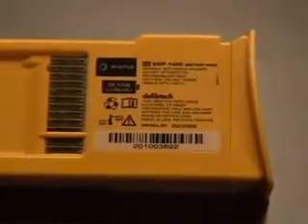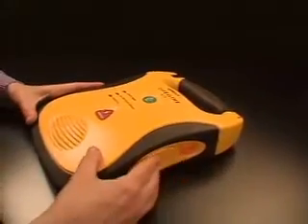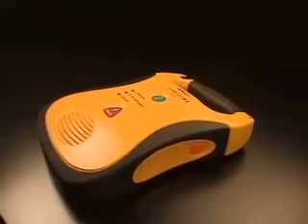If you have a spare battery pack, check its install by date, which is printed on the label. The battery pack should be installed into an AED before that date. After the battery pack is installed in a unit, the AED will monitor the condition of the battery and inform you when the pack should be replaced.